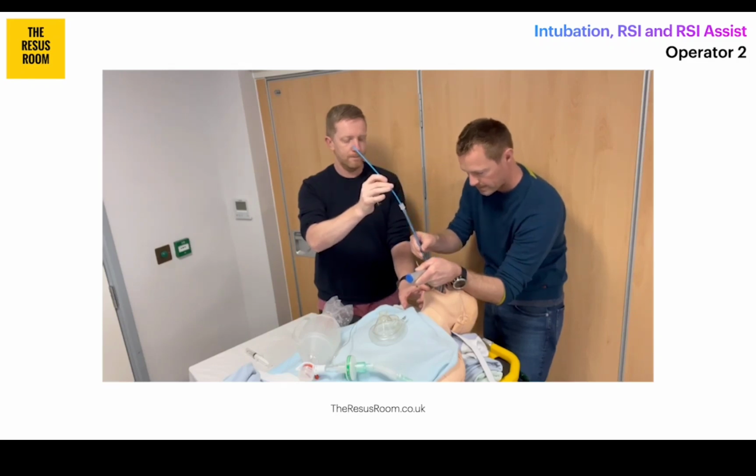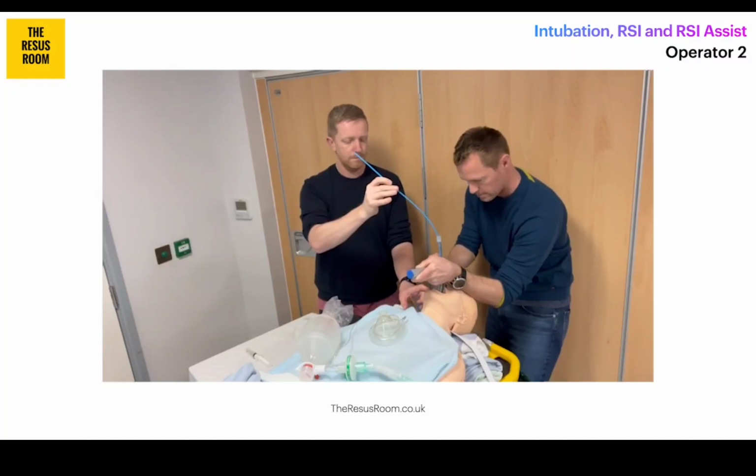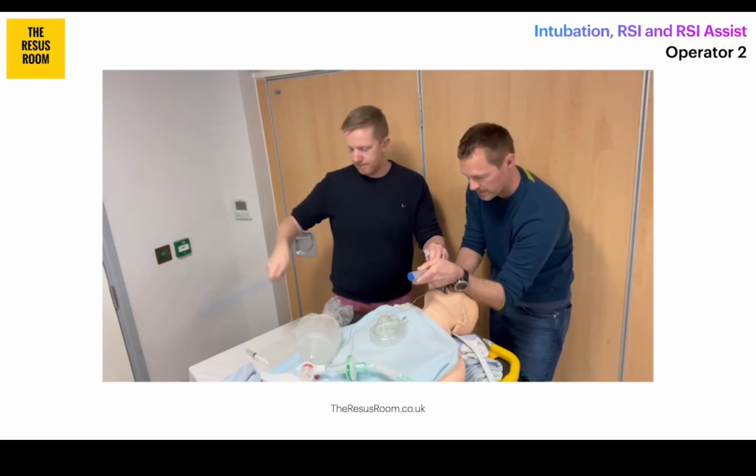And with his other hand, notice that Simon's now gone down to the corner of the patient's mouth and he's pulling it gently down towards the bed. Now, that's a really nice little move. That just opens up the right-hand side of the mouth and allows me to advance the tube really nice and smooth. And you can also apply that technique before bougie insertion. That just helps to reduce the oral angle by just a few more degrees and improves your chance of first-pass success.